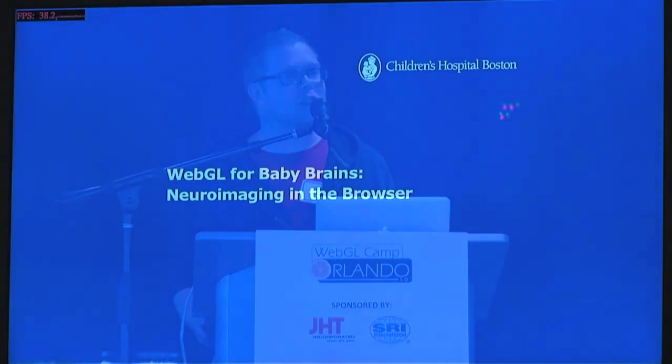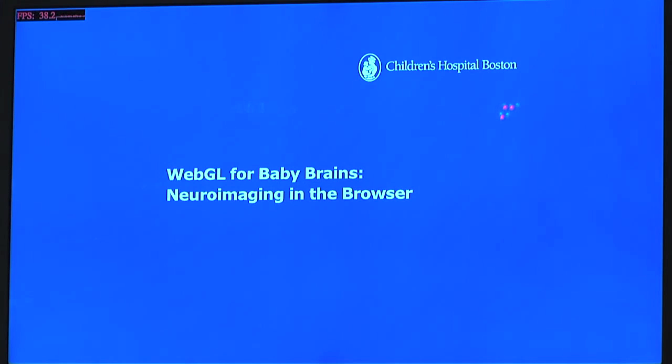So thanks, Monty, and thanks, JHT, for hosting. So far, we had a fun event. And so my name is Daniel Haehn, and welcome to WebGL for baby brains, neuroimaging in the browser. So our motivation is, you see a lot of movement concerning games or animations with WebGL, but we actually use it to display research results at our facility.